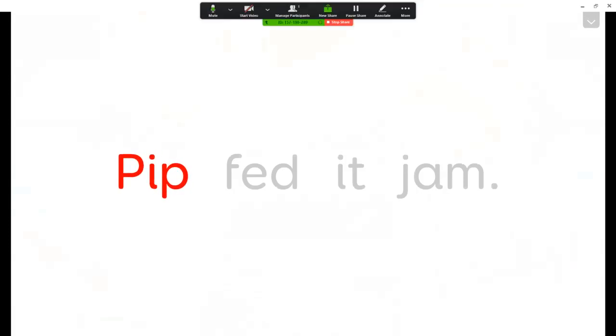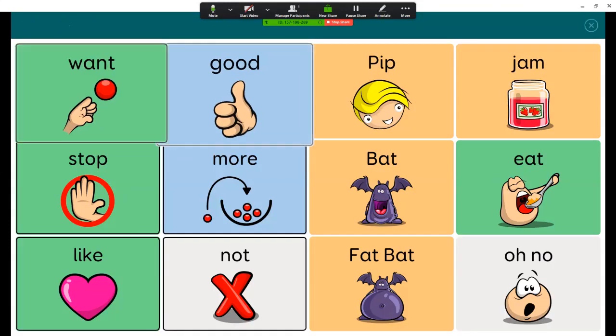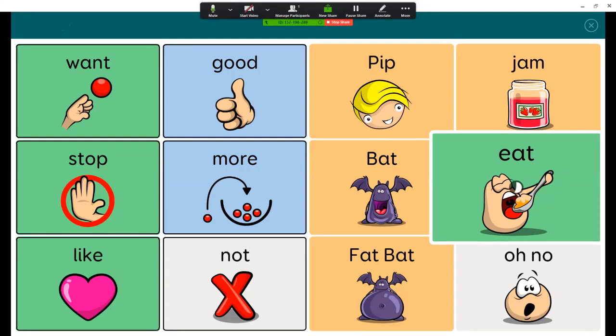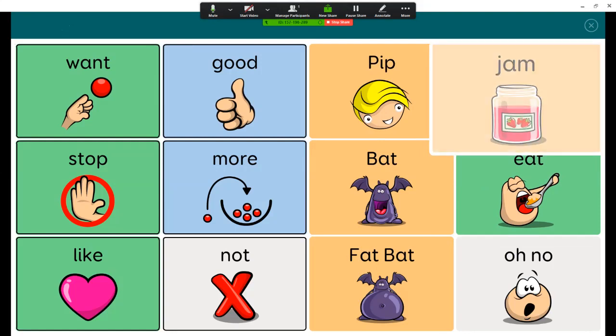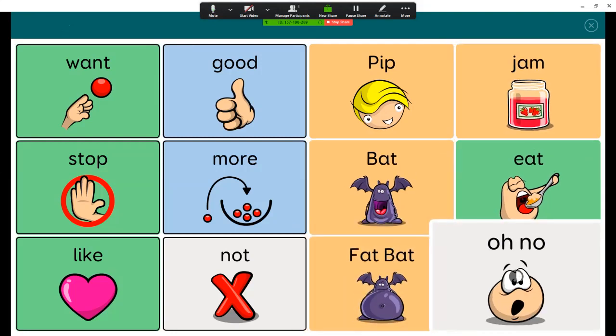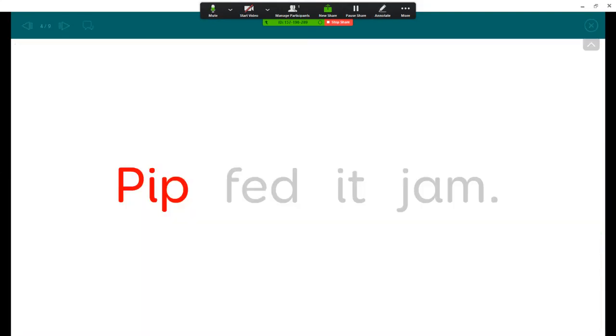So what I'm going to do now is play around a little bit in this drop down where I can go to the next page. We can jump into a quick chat. So maybe we wanted to talk about activities throughout the story, just as we would do with a normally developing child. We would say, oh, that's crazy. He was eating, well, we didn't get to this yet, but he's eating all of that jam. And if you eat too much jam, you might become a fat bat. Fat bat. And that's, oh no. Oh no. Right. So you can kind of see how this all plays together, and it's just a very clean layout for reading these stories.